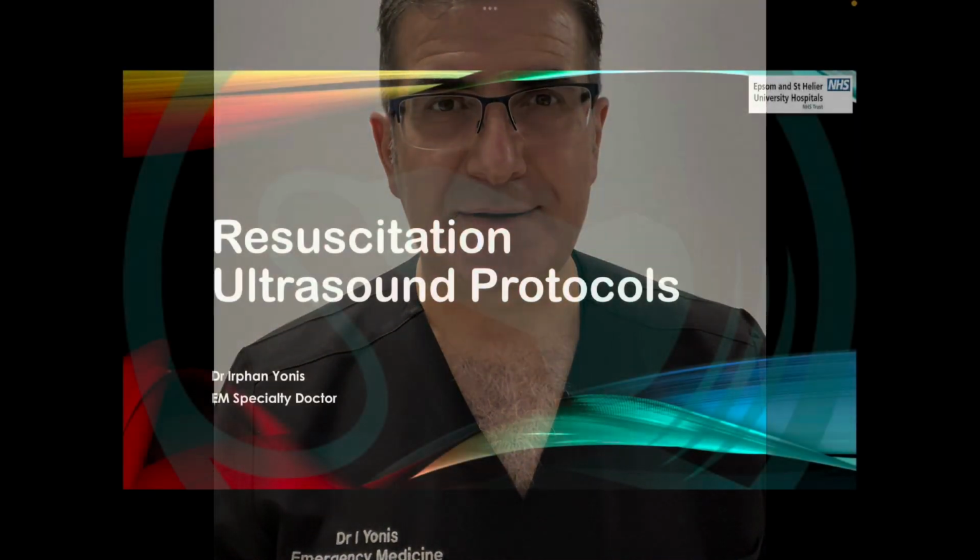We would like to talk about the commonly used protocols to evaluate patients who present to A&E, or accident and emergency department, with non-traumatic shock. There are different protocols. We are going to concentrate on the most important ones which are used in A&E or emergency department. So stay with us.